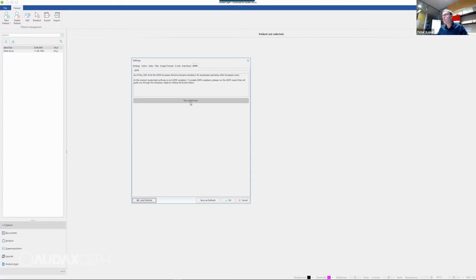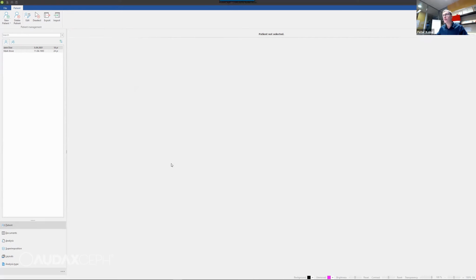Okay, one thing which is not that visible is that we improved licensing restoration. If something goes wrong with your license, you can simply restore it, and it will work. Before we had to change it, and it was not that often that it happened, but we found out that it's good to do that improvement, so that your work is smoother, that you don't need to call us.